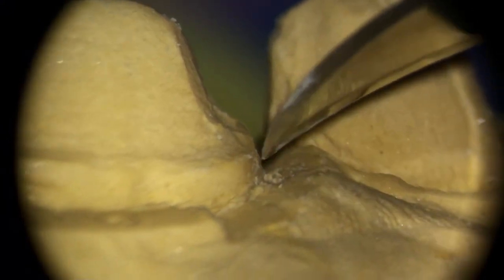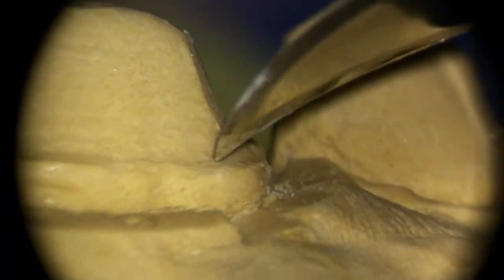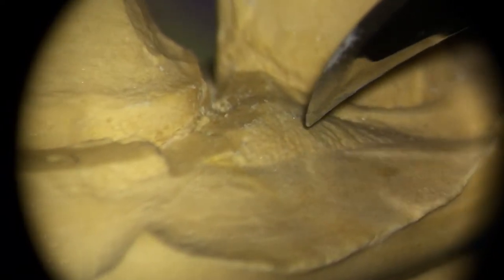A nice shoulder margin like this, if it's equigingival with the gum, sometimes the only thing you have to distinguish between tooth and gums is the texture. So you're just looking at the diamond marks versus smooth or stippling on nice healthy gums.